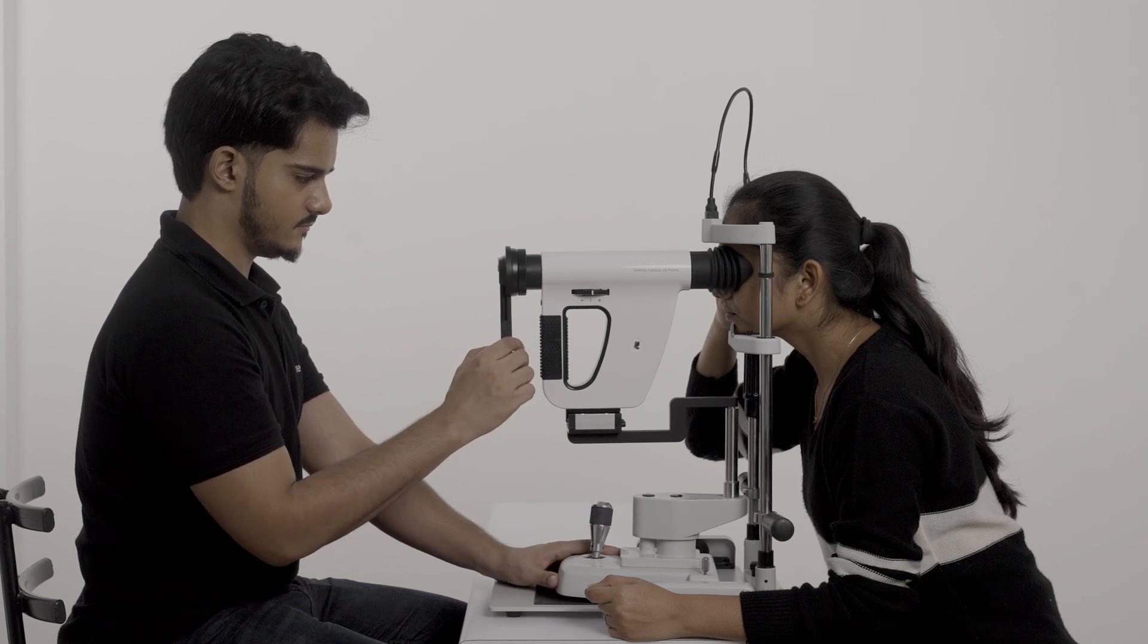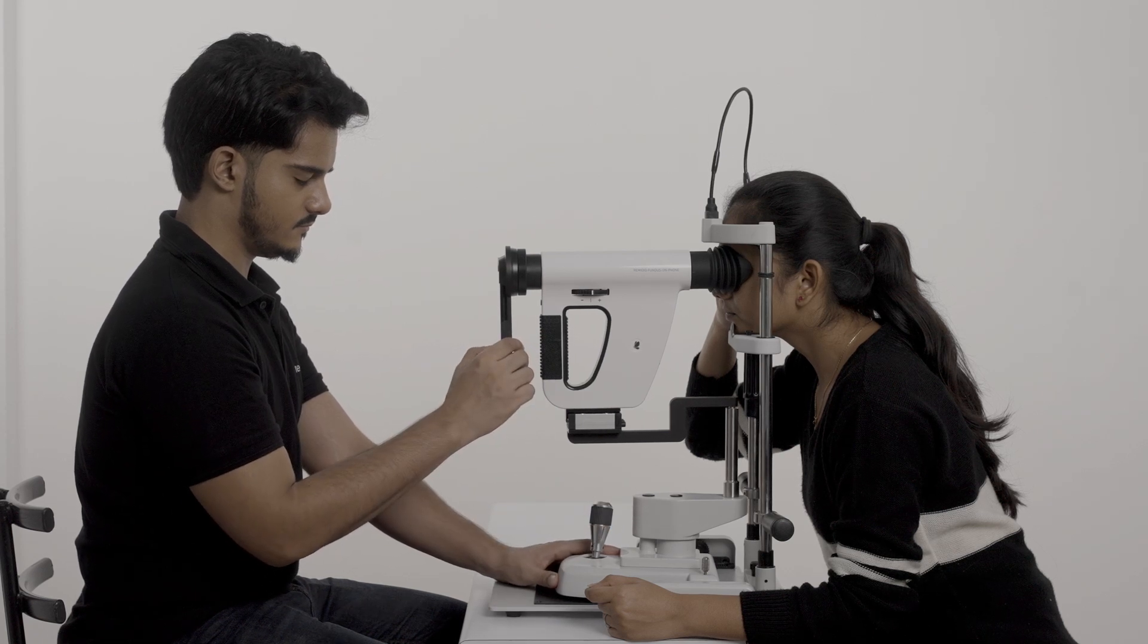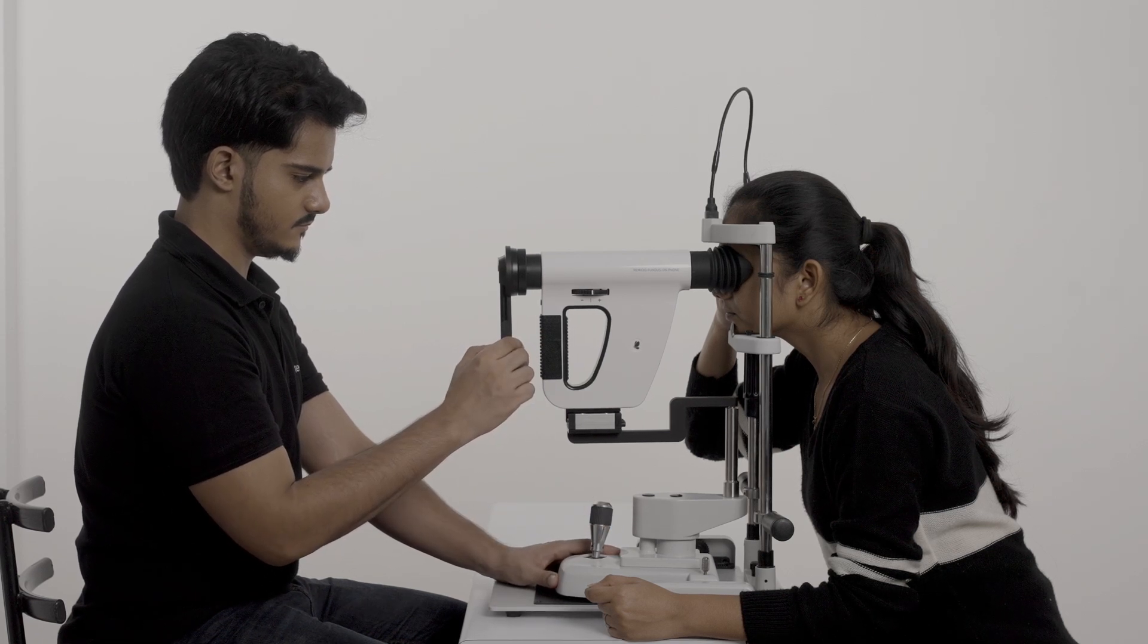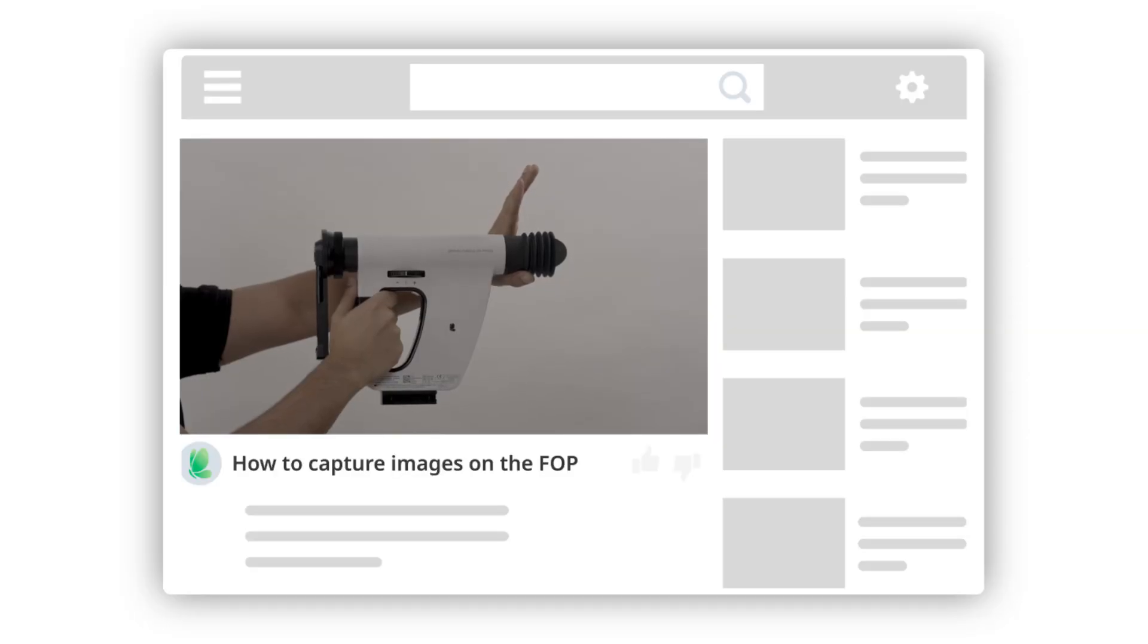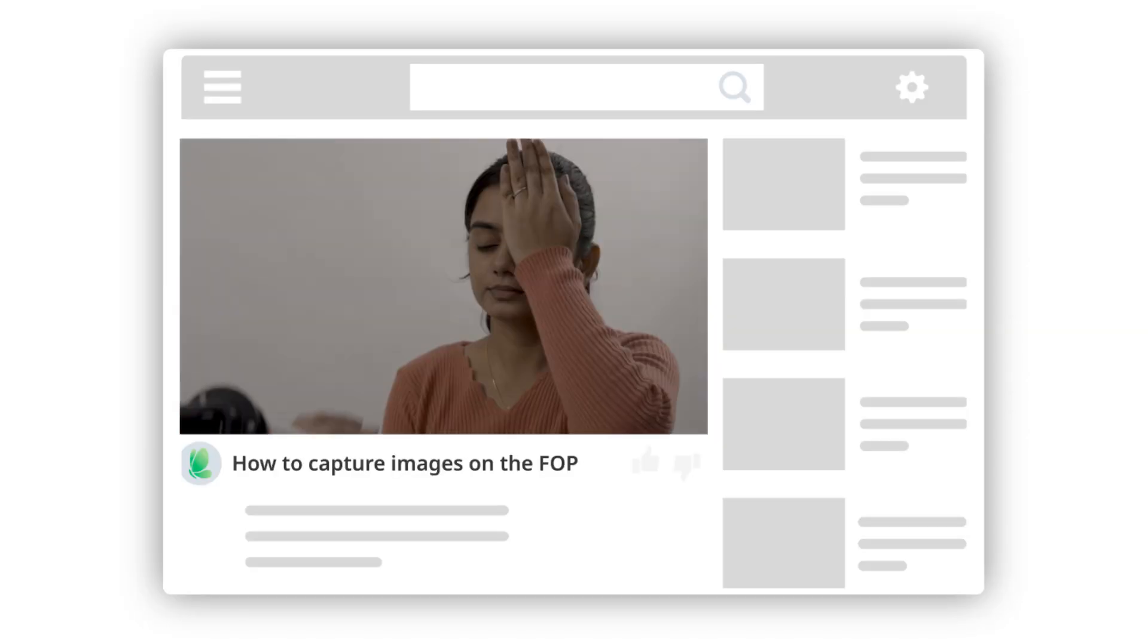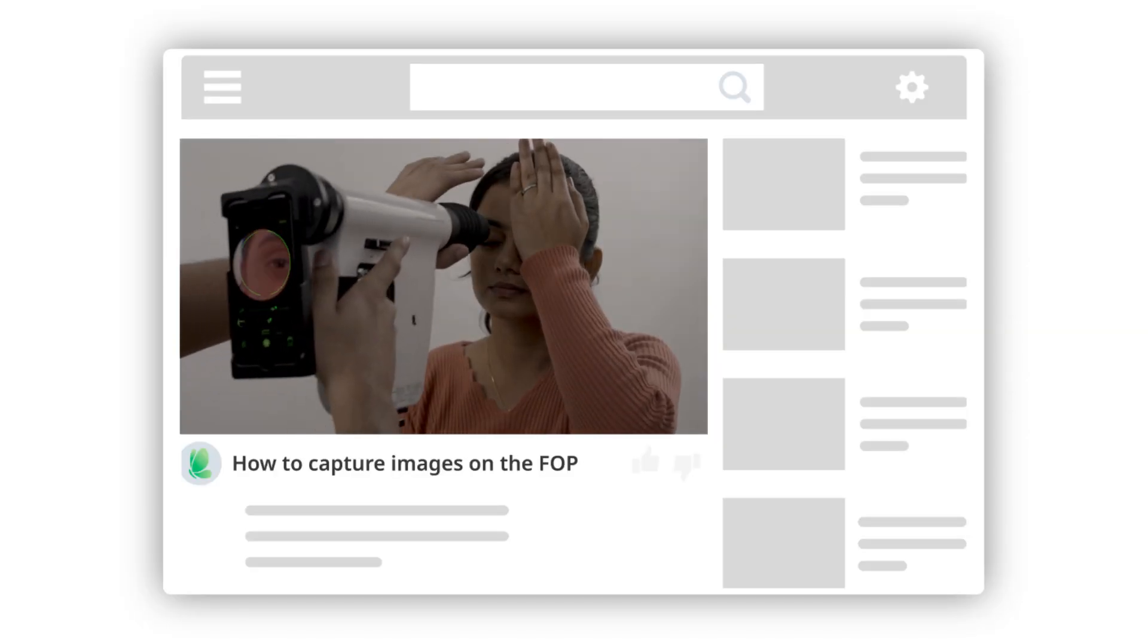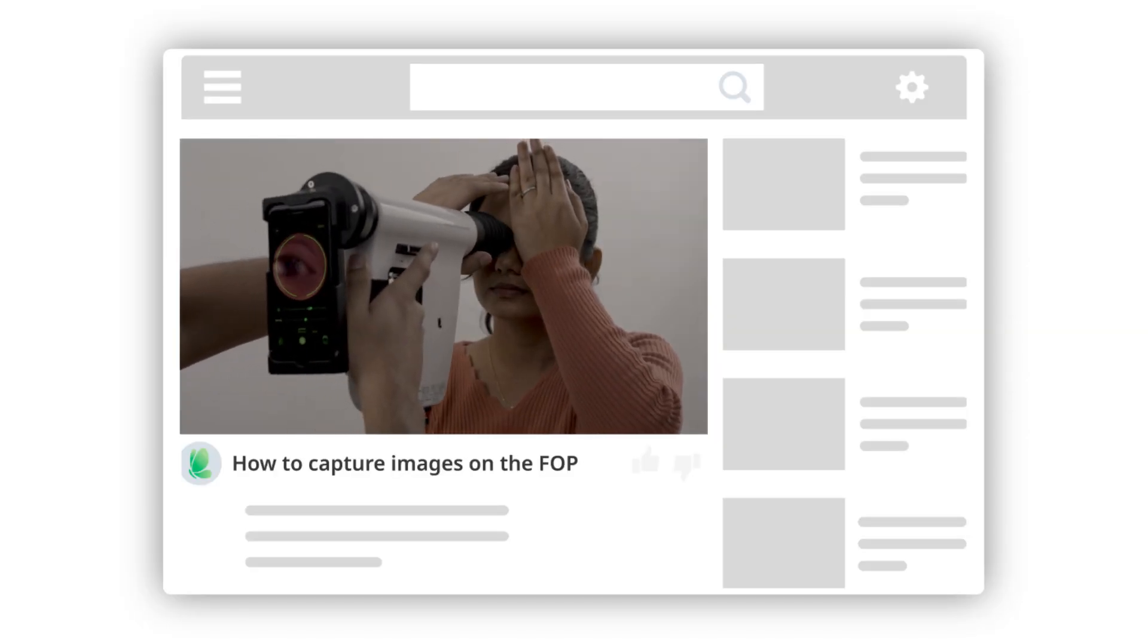Make sure that you've learned the basics of capturing images by watching the video how to capture images on the FOP before you continue.